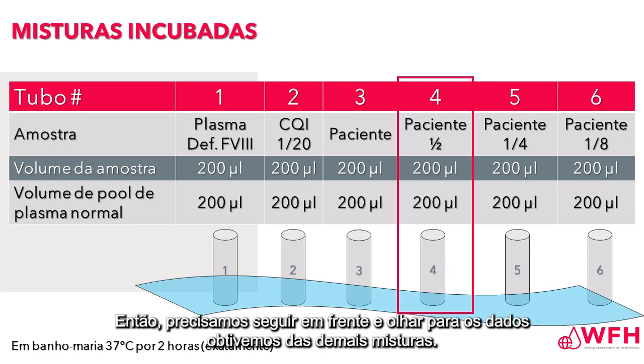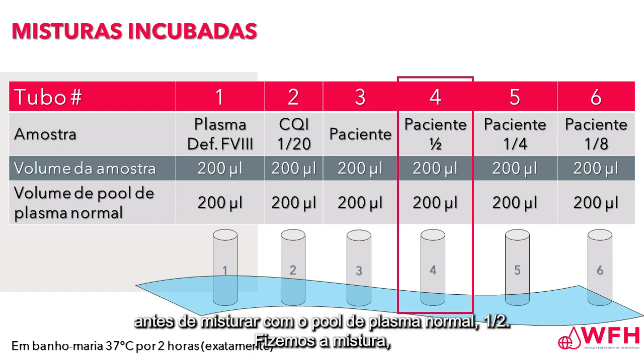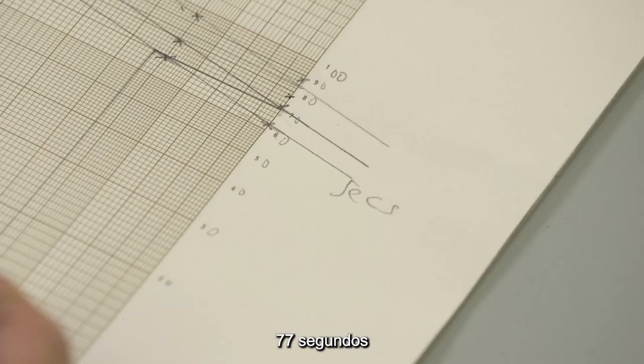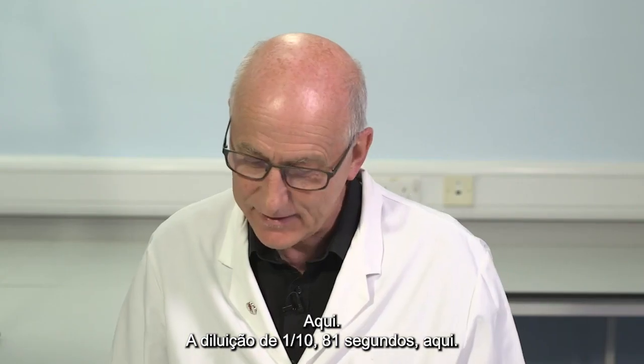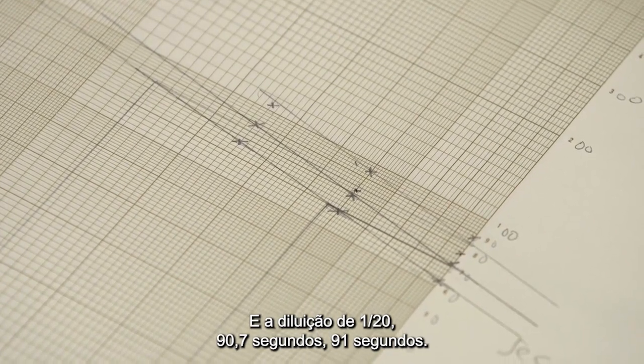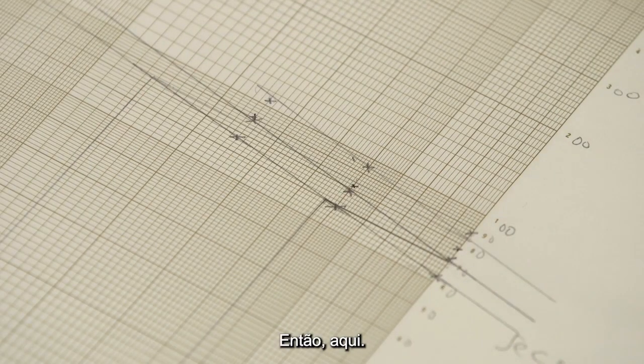So we need to move on and look at the data we obtained from the other mixtures. In the next mixture, the patient sample, the test material, was diluted 1:2 before we mixed with pooled normal plasma, 1:2. We made the mix, we've got the clotting times. So the 1:5 dilution, 77 seconds here. The 1:10 dilution, 81 here. And the 1:20 dilution, 90.7, 91 seconds. So here.